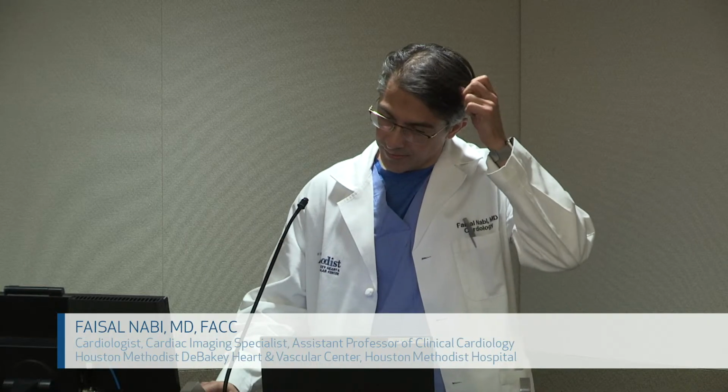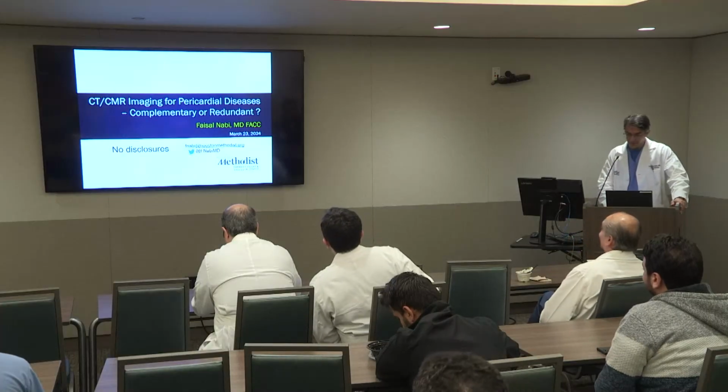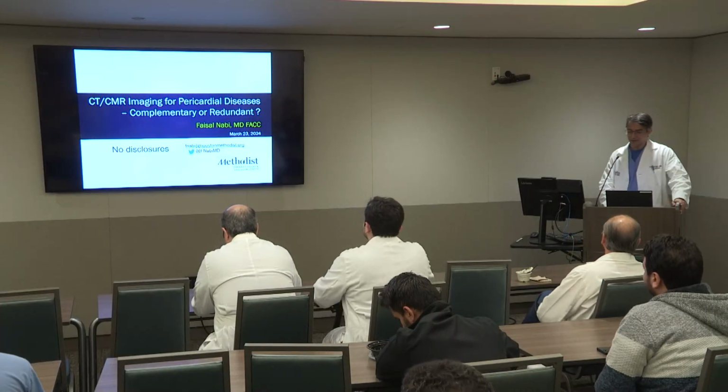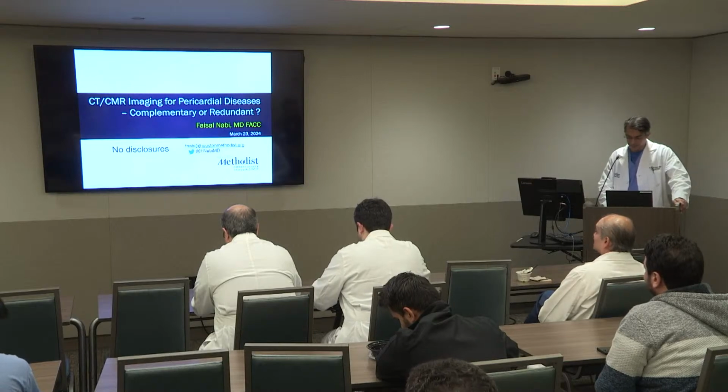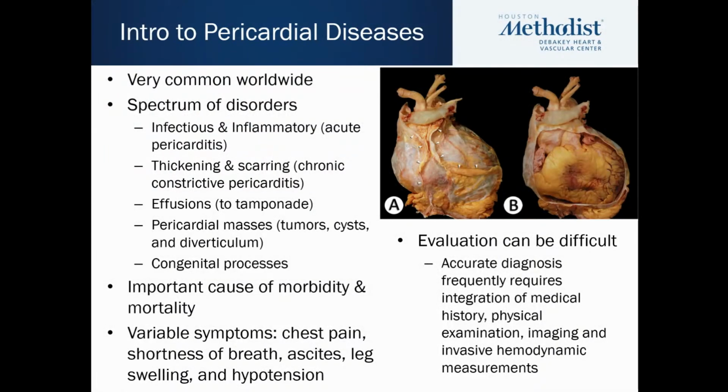Okay, so I have the task to show you how we can use CT and CMR for pericardial disease, and hopefully convince you that it is a much needed tool. So just a little bit about what was already discussed.